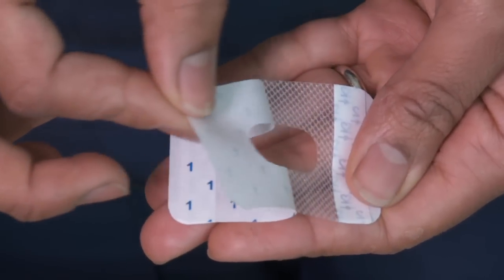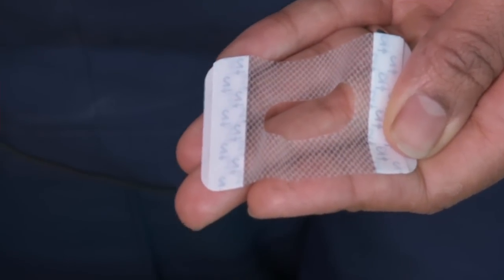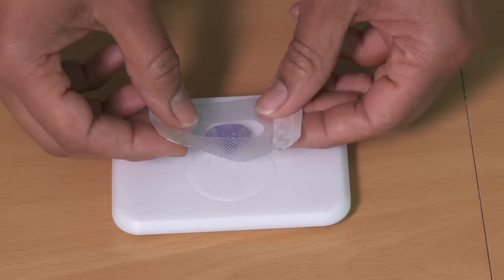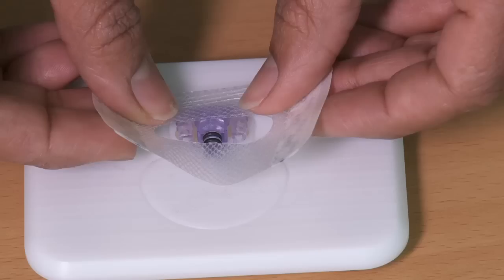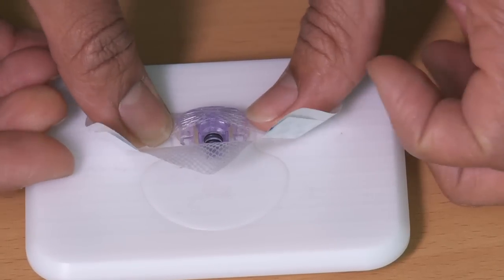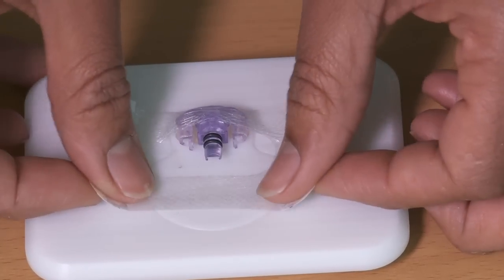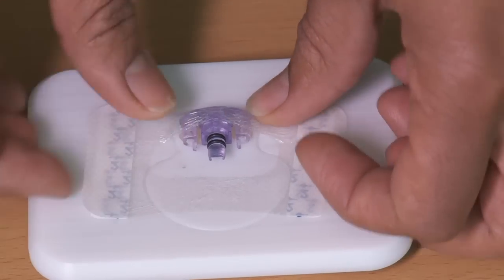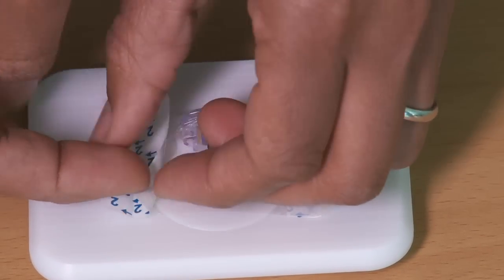Removing the first part marked number one, give the dressing a stretch as you place it down over the top of the sensor, really making sure it's firmly stuck down, then remove the side tabs marked two.